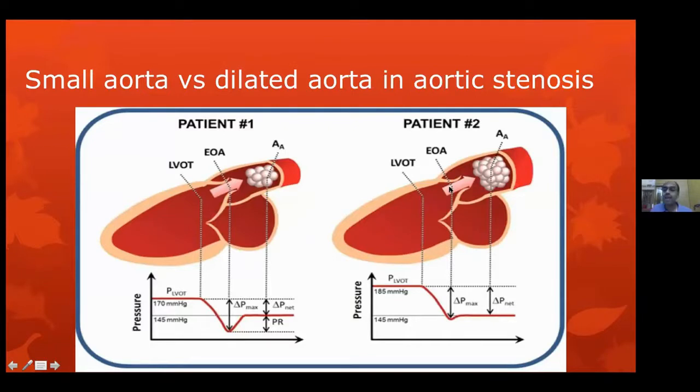Whereas that doesn't happen often in a bicuspid aortic valve in a youngster who has got a severe gradient, and this gradient will be matched with the cath gradient that you get in the cath lab. So the phenomenon of pressure recovery, why it recovered was because this was a smaller area. Why were we discussing this?